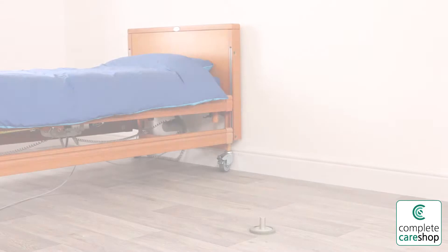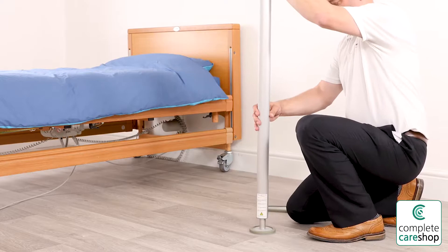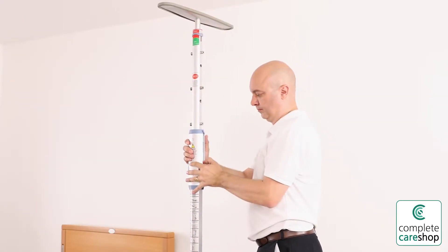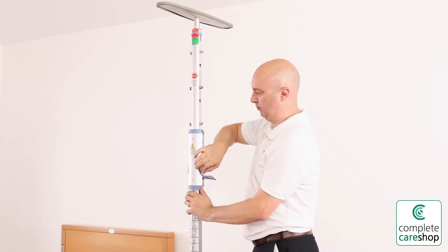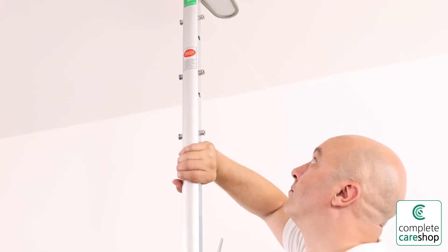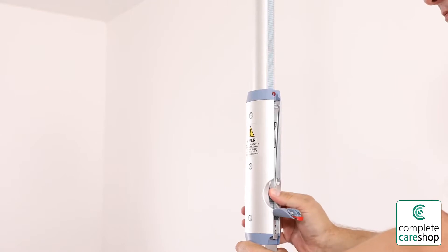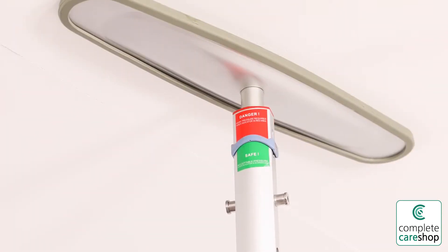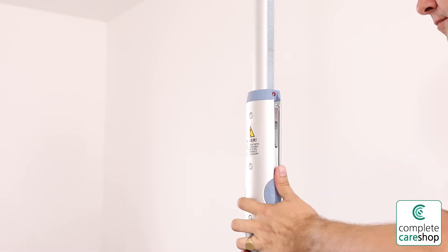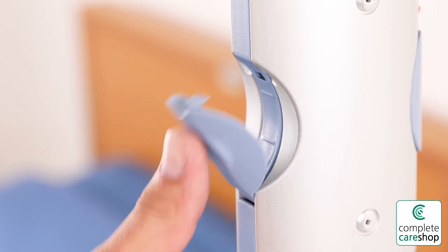To assemble the gantry, simply place the bottom plates on the floor in the approximate position you expect to use them and insert the support post. On the top plate, release the safety lock using the red button, press the ratchet button, and push the lever up until it reaches the magnet symbol. Then extend the support post until it reaches the ceiling and you hear two extra clicks. Push the lever down to pressure fit the support post, ensuring that the meter at the top moves into the green safe zone, then lock the lever back into place and close the safety lock.